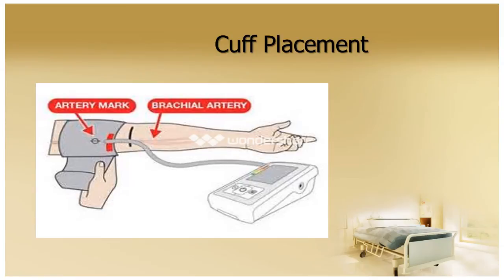Further down, you'll see the brachial artery. It's labeled here. This is not where you'll check the pulse, but this is essentially where the pulse can be felt when you're checking for how high to pump the cuff up so that you'll see the numbers.